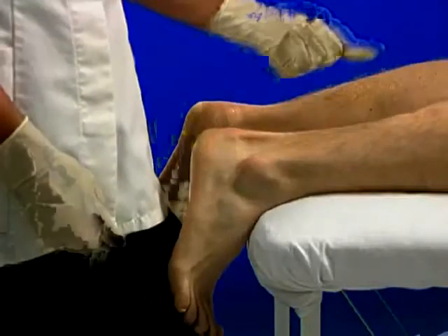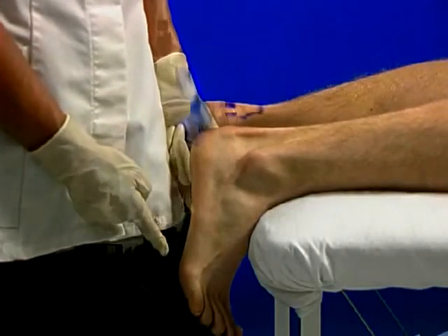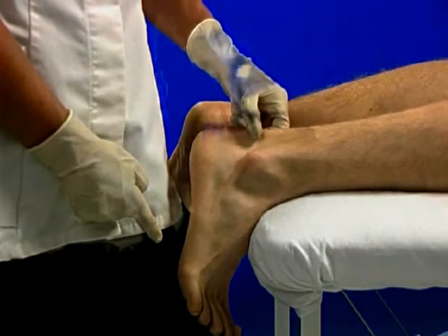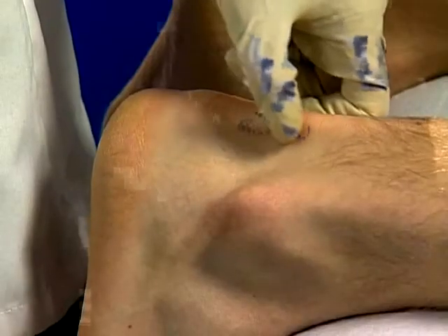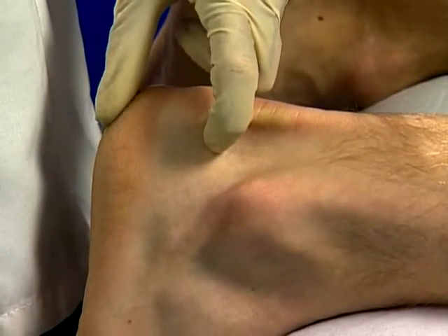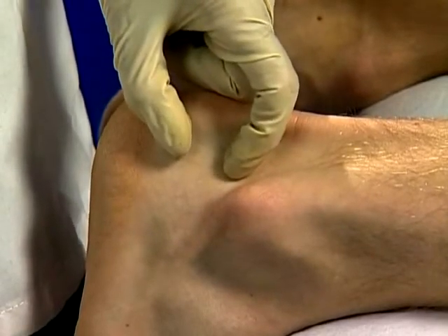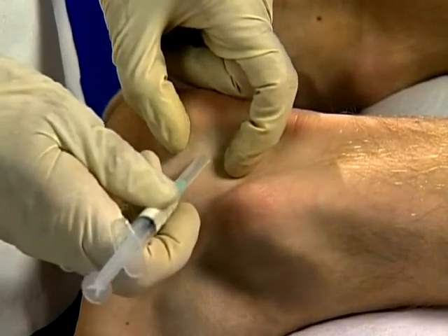The patient lies prone with foot strongly dorsiflexed against the injector's thigh. Identify and mark the centre of the tender area. Clean and firmly stretch the skin on one side of the tendon and rapidly insert the needle perpendicularly.